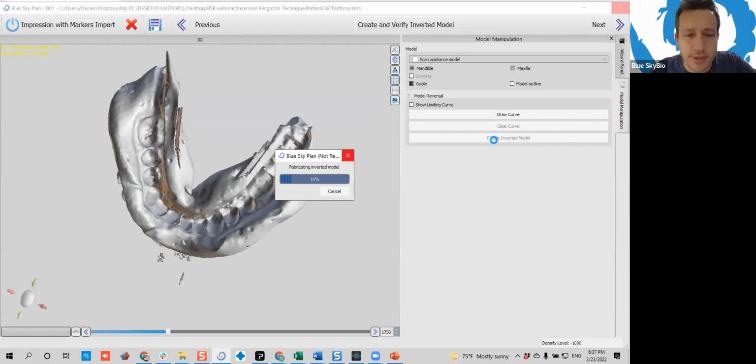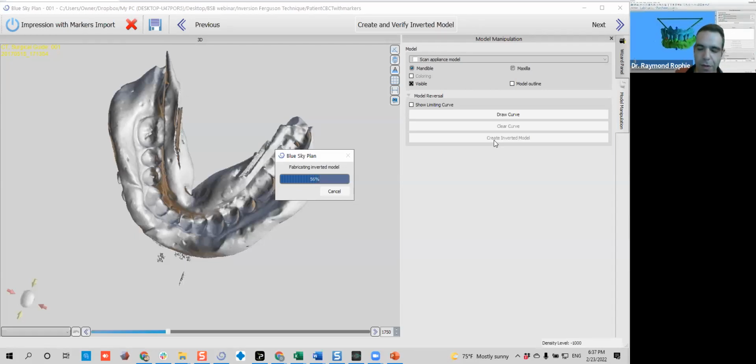So while this is inverting, can you provide a little bit of context? It's basically what type of scans are needed in order to create a surgical guide, and when is this used as opposed to a standard optical or model STL scan? Sorry, Michael, you were cutting a little bit, but I think you asked me about the type of data acquisition, something on the CBCT and the scan, but I couldn't hear you well.